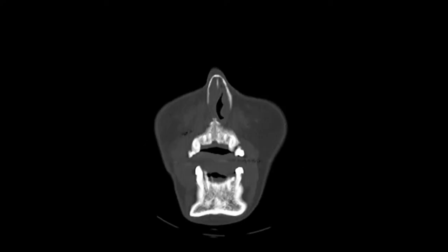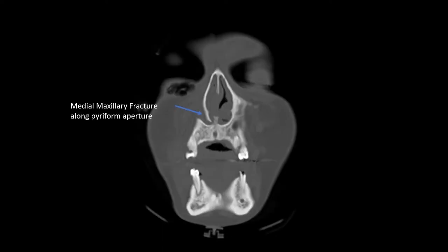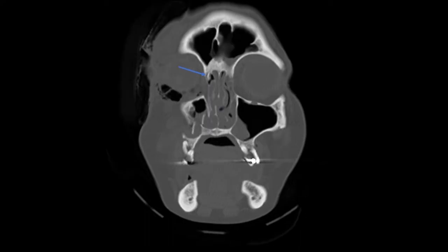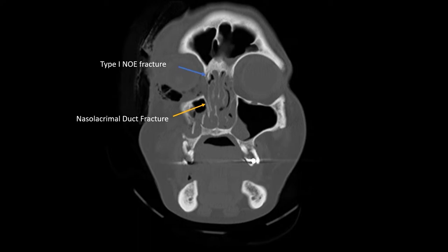We'll scroll through the coronal scans next. Here you can see a very obvious medial buttress fracture. You can see that this is severely medialized and is obstructing the nasal airway on the right side. Here is a Type 1 NOE fracture that we saw from the axial cuts. The medial canthus is likely intact and remains attached. You can see that this bone segment is fairly large without comminution — as such, this is a Type 1 NOE fracture. Here you can see the nasolacrimal duct, and it has obviously been fractured and displaced.